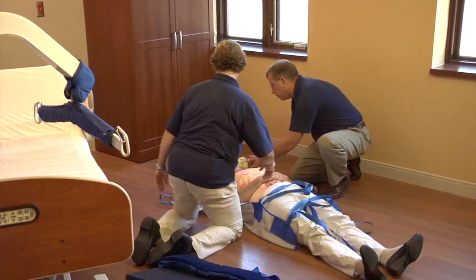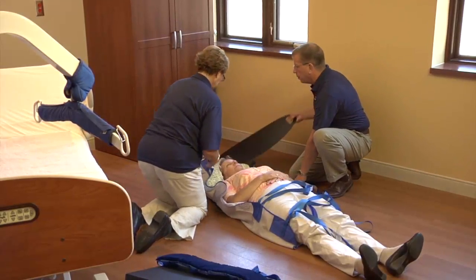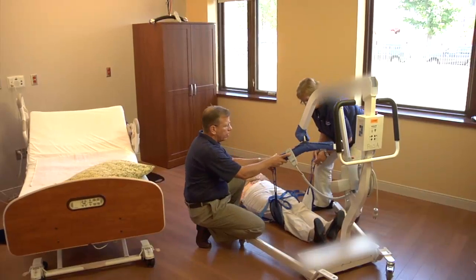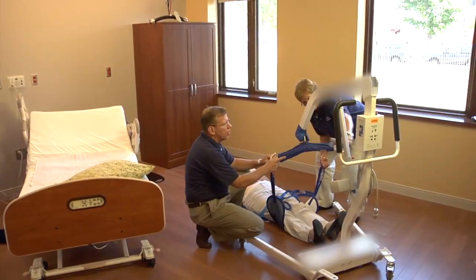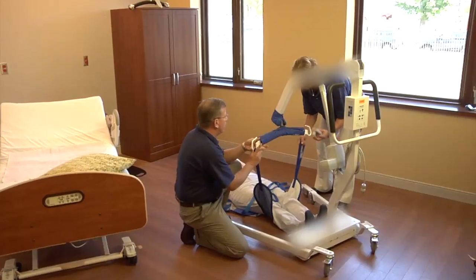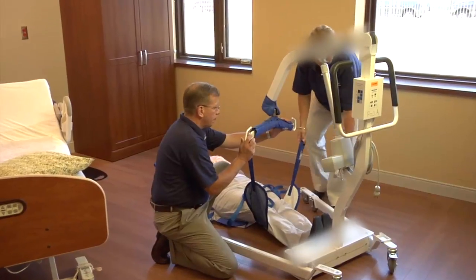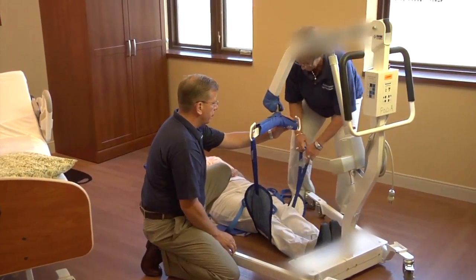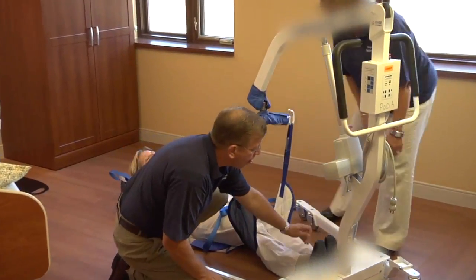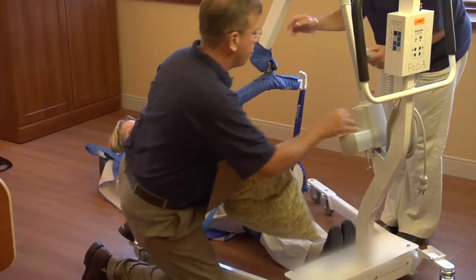We're going to use a limb strap here and show you how you can lift the lower legs, which could be very heavy, by connecting them to the carry bar, running the limb strap under both legs. The mechanical lift will lift the legs and allow us to position the lift in the right position, which is very close to the patient. We're going to put a pillow on the base of the lift for the comfort of the patient. We're going to be sure that we position the legs on the side of the lift where the actuator is not.